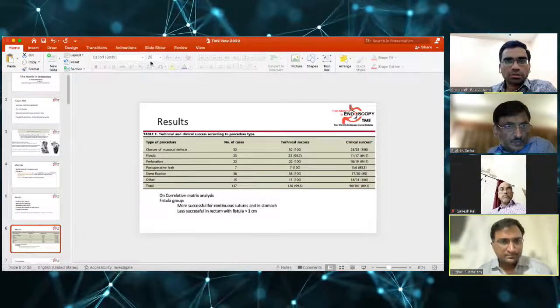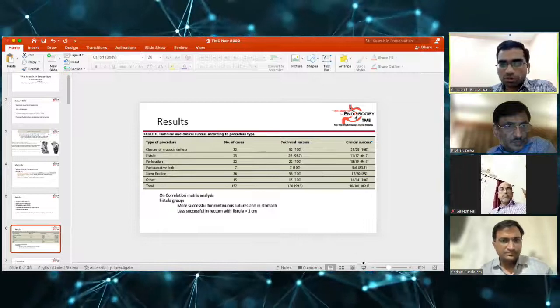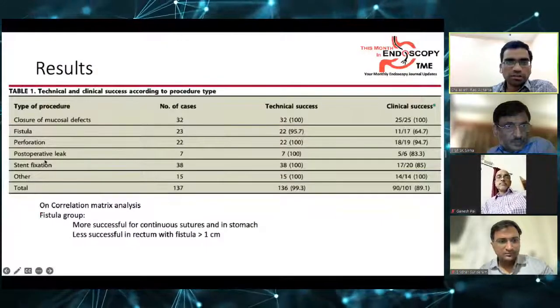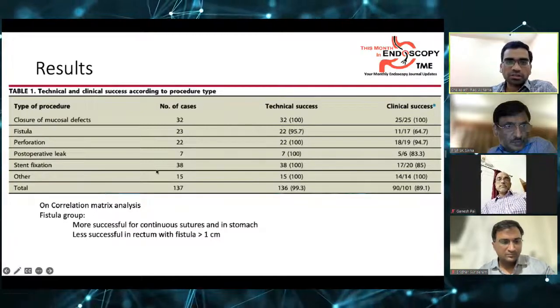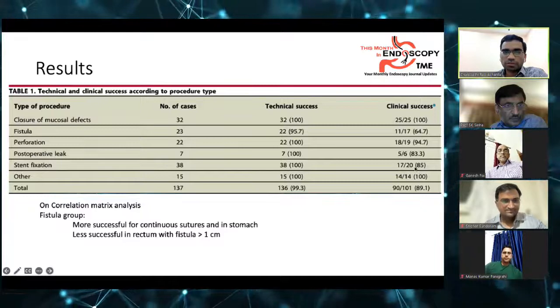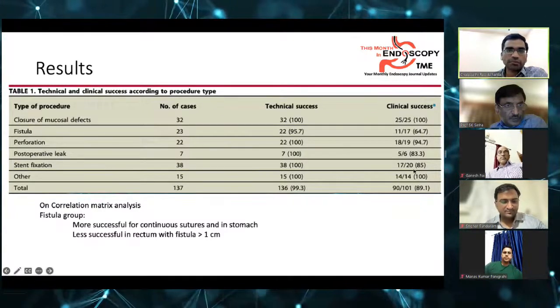Okay. Right. Usually these stent devices, especially the suture devices, are expected to give a better result in stent fixation. But in almost 15%, some migration still happened.